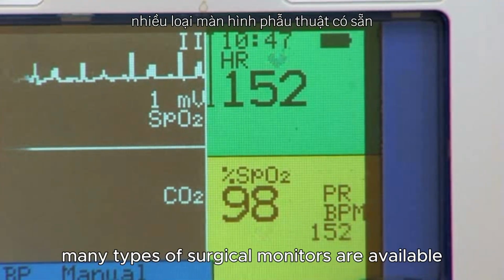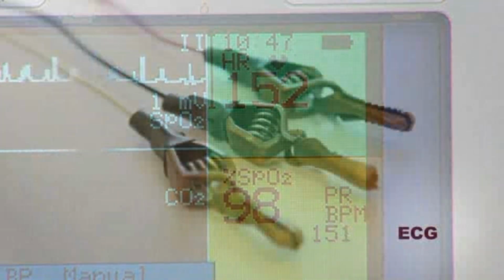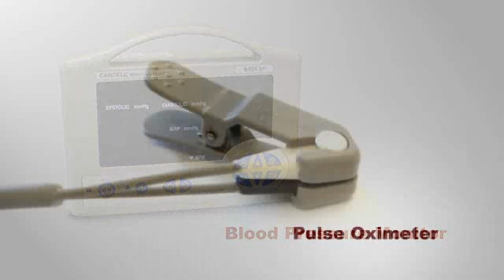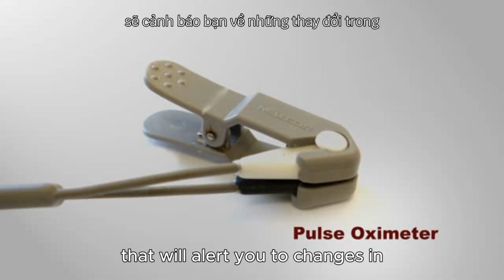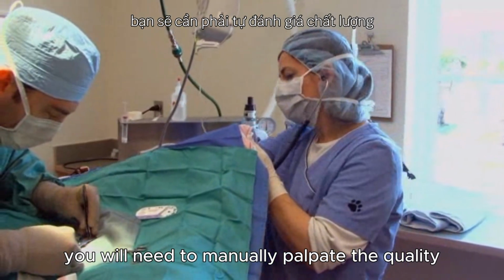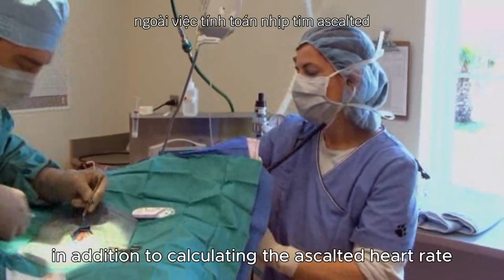Many types of surgical monitors are available that will make the heart monitoring more accurate. ECGs, stethoscopes, non-invasive blood pressure monitors, and pulse oximeters are all common instruments that will alert you to changes in the circulatory health of the patient. Along with electronic monitors, you will need to manually palpate the quality and strength of the pulse in addition to calculating the ausculted heart rate.